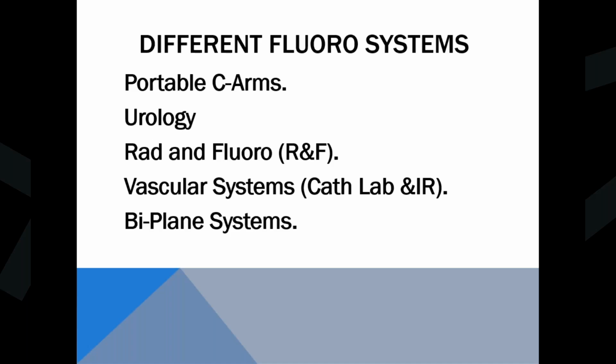Okay, so what are some of the different systems that you might run into in the hospital that use fluoroscopy? Probably most people would be familiar with the portable C-arms that you see in the OR. They're fairly abundant, and if you work around the OR in those areas, you'll run into the C-arms all over.